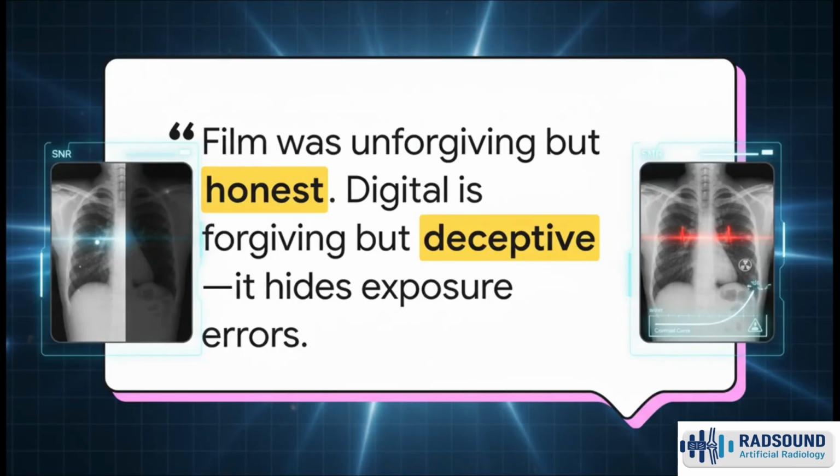But modern technology adds a really interesting twist to this challenge. This quote from Dr. Jafar just nails it. With old school film, if you used way too much dose, the film came out black and was ruined. It was honest about your mistake. Modern digital systems, though, are incredibly forgiving. They can automatically fix an overexposed image and make it look perfect. But that forgiveness, it's deceptive because it can completely hide the fact that the patient got way more radiation than they needed to.